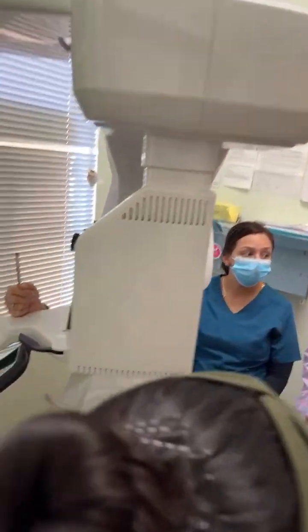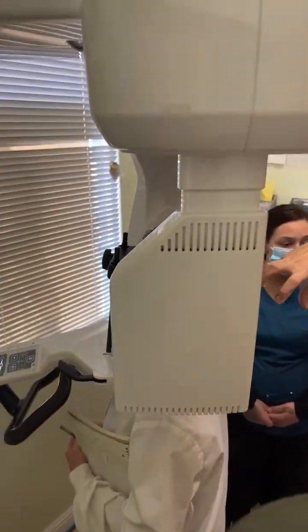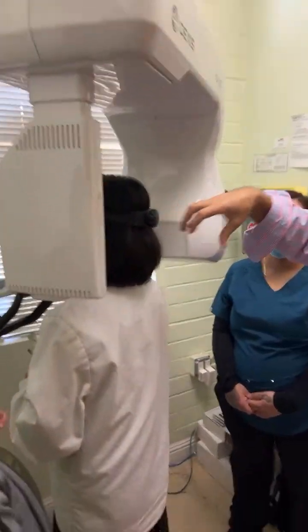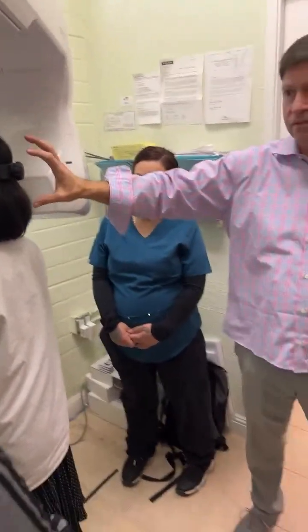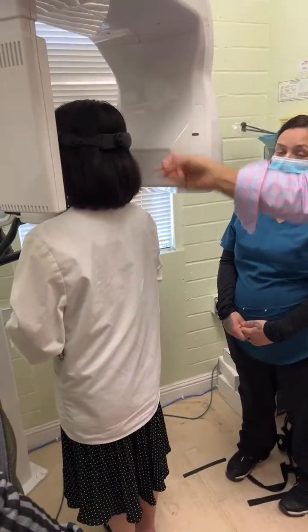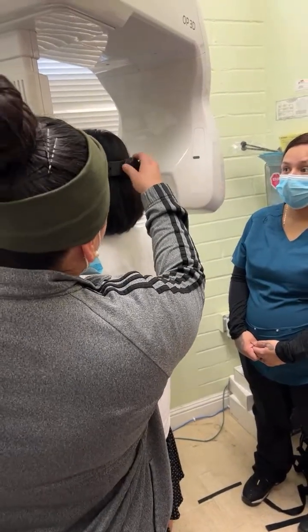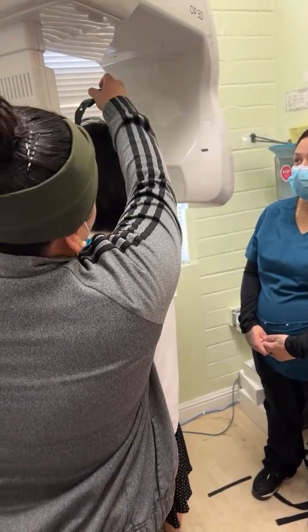You could have sweaters, but if it's big hoodies that are bunched up and they have a jacket and a hoodie and it's all sitting out here, you don't want that. Especially the hair buns, even the man buns, right? And the big buns of hair out here. Gotta release it, take the bun out. She's been trapped for 30 seconds. Okay, does that make sense?